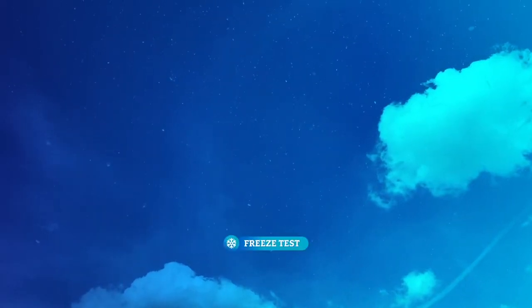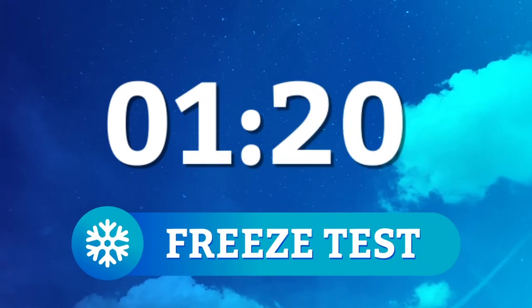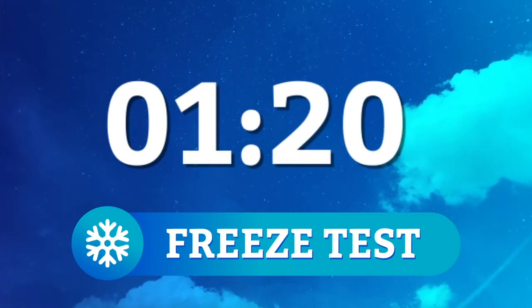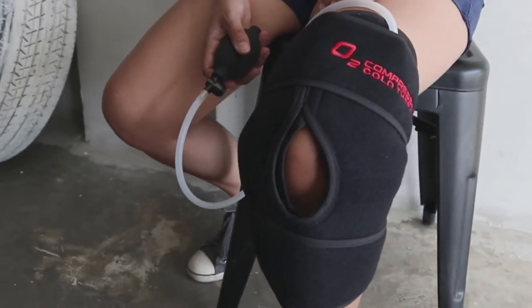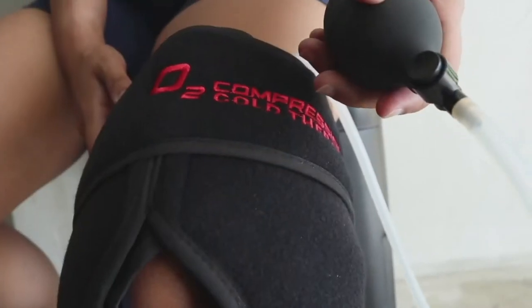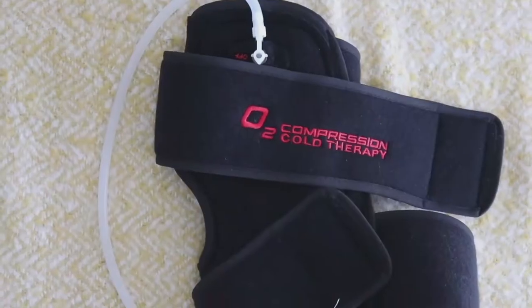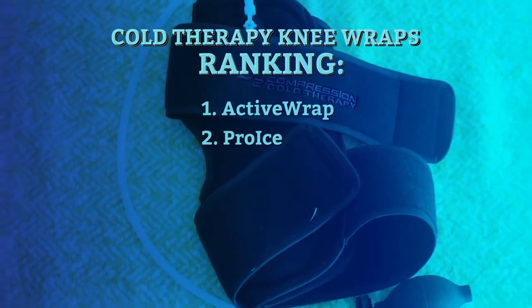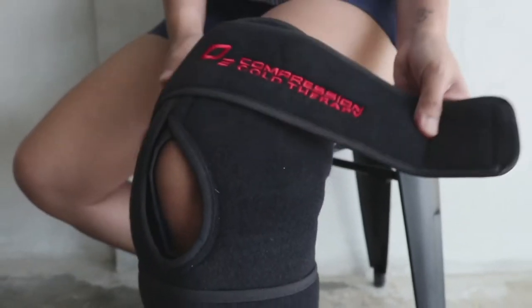It's really cold too. During our tests, O2 stayed cold for an hour and 20 minutes. The air compression really complements the temperature — you don't need to undo the strap so much when you can just pump away to adjust the compression and tightness of the wrap. All things considered, the O2 compression knee wrap is well designed and effective. It's just a tad too bulky compared to the top two knee wraps on this list.